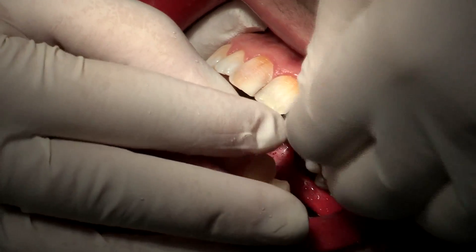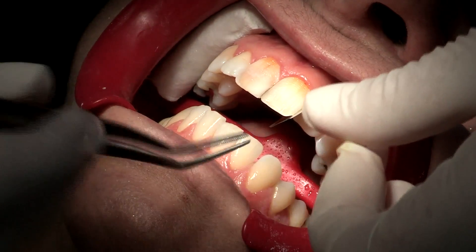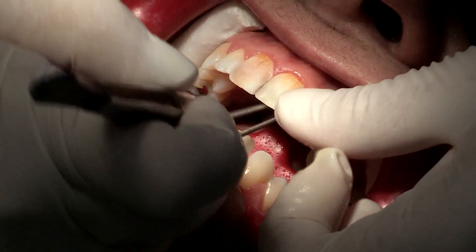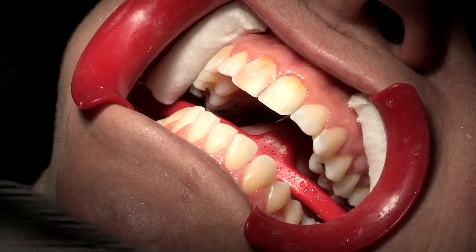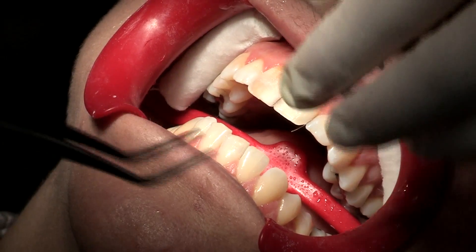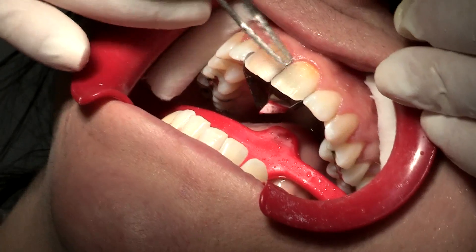The separators can be anything you usually use at your practice. I like to cut my cellulose metal matrixes and then pull them backwards, not to protrude on the labial surface — it's very tight teeth. You can use cellulose strips, you can use plumber tape, anything. We put one separator and then we put the other one. I put three separators to separate the teeth and minimally prep the teeth.